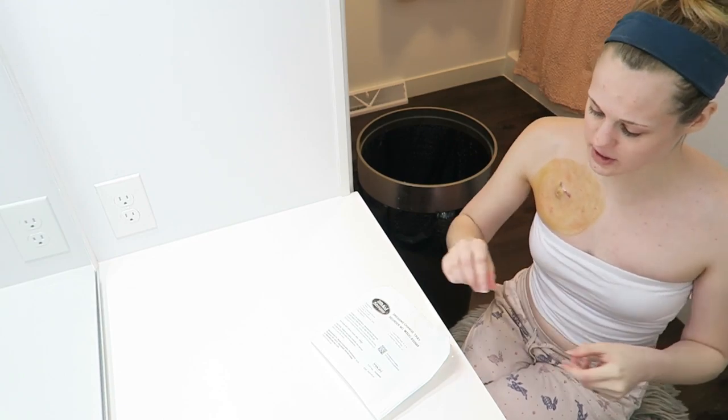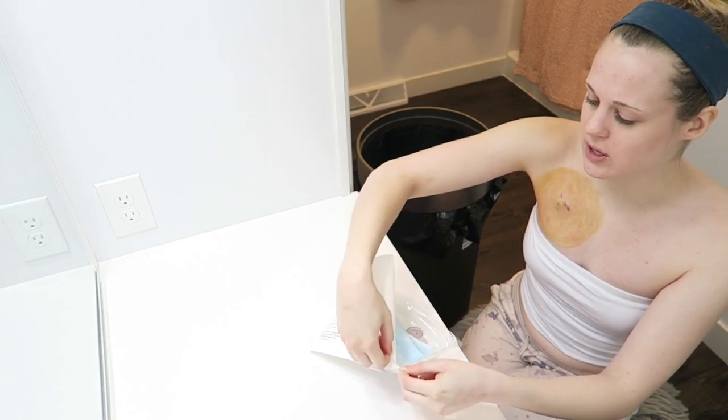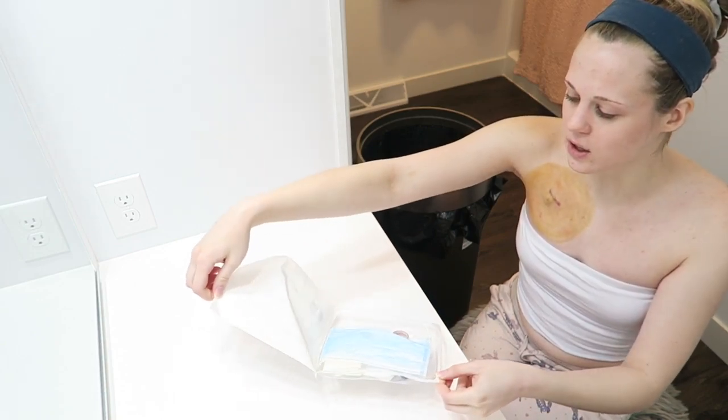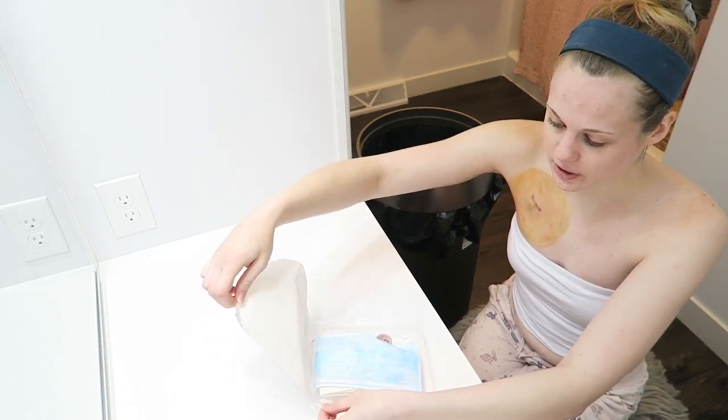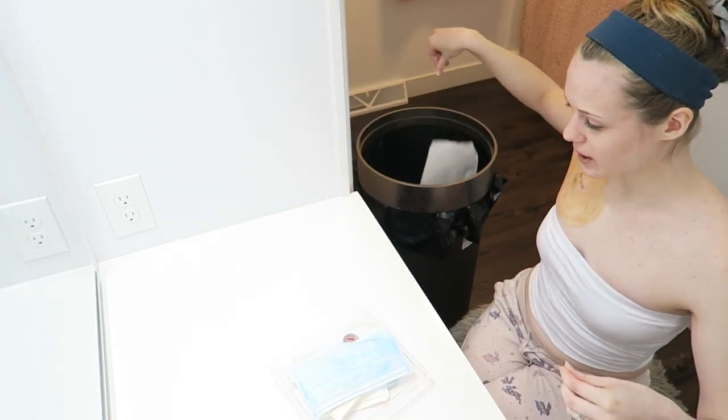Now that I've washed my hands and used hand sanitizer, I'm going to open this. You wanna make sure you are not touching anything inside. Once you touch an object, it is no longer sterile unless you have sterile gloves on. So I'm gonna throw that away.